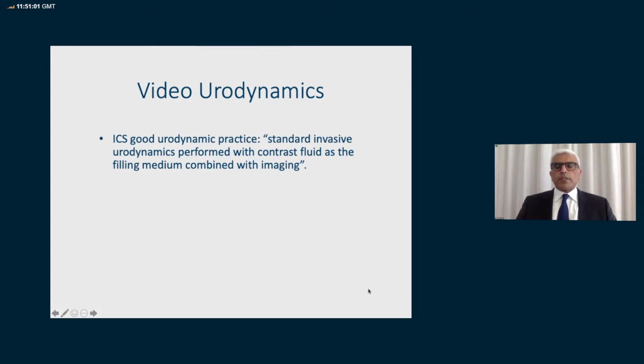It is performed with a contrast fluid as a filling medium, and the standard urodynamics with pressure flow studies is combined with imaging to get the video or X-ray images. As one of my colleagues used to say, with video you see, without video you don't see.